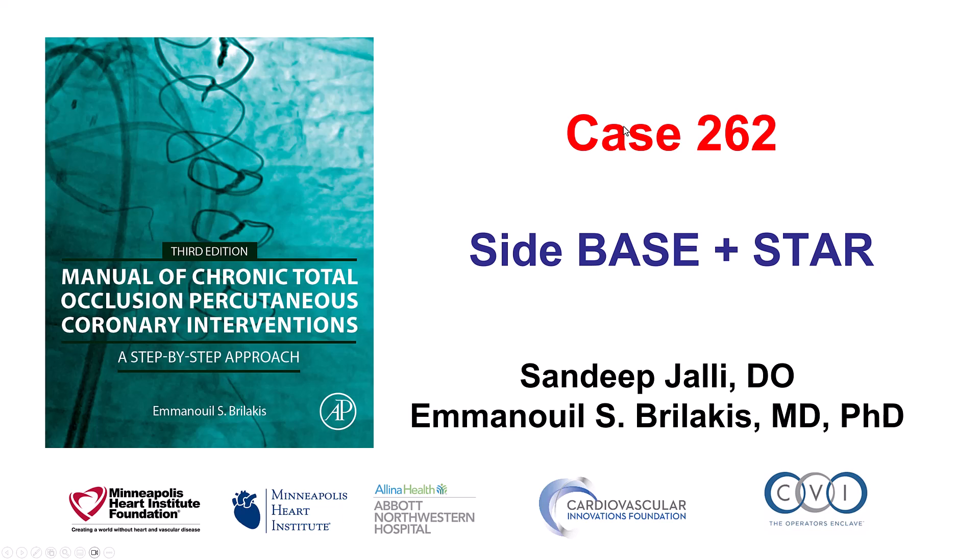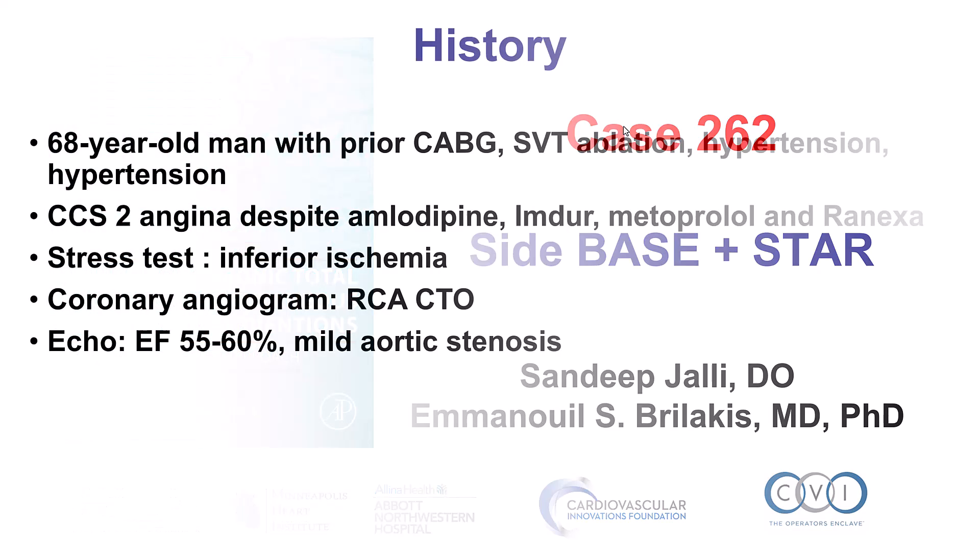This is Sandeep Jalli and Manos Brilakis presenting case 262 for the Manual of CTO Interventions. This is a case illustrating use of the side-based technique as well as the STAR technique for re-canalizing a right coronary CTO.